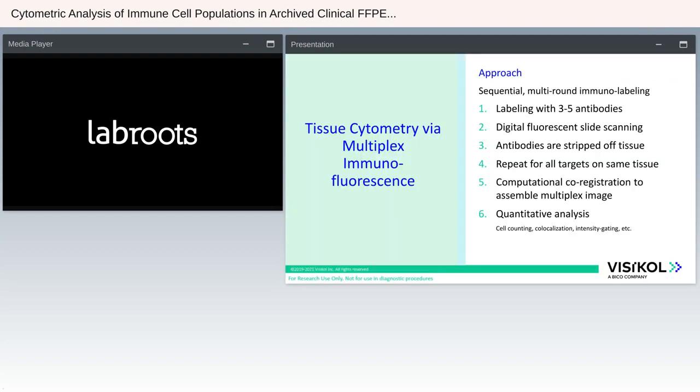So how does this work? The approach is essentially sequential multi-round immunolabeling. The way that this works is by taking a tissue section, labeling with 3 to 5 antibodies, then we do digital fluorescent slide scanning. After that, we strip the antibodies off the tissue using a proprietary reagent that we developed here. We repeat this process over and over until we've covered all the targets on that same tissue. Then we use a computational co-registration algorithm to assemble this into one big mega stack of an image that contains all the different channels. And that allows us to conduct quantitative analysis where we do cell counting, co-localization, intensity gating, etc.